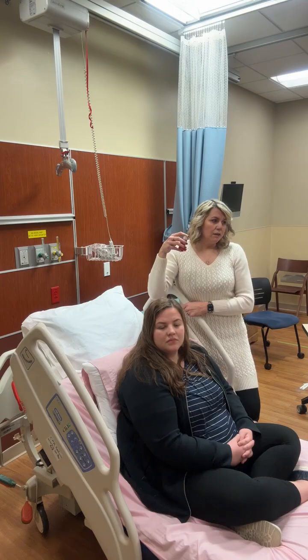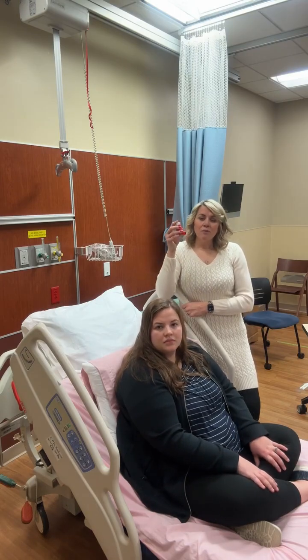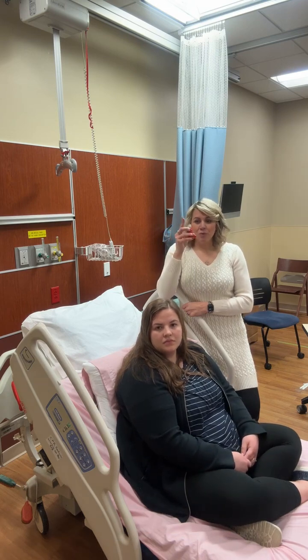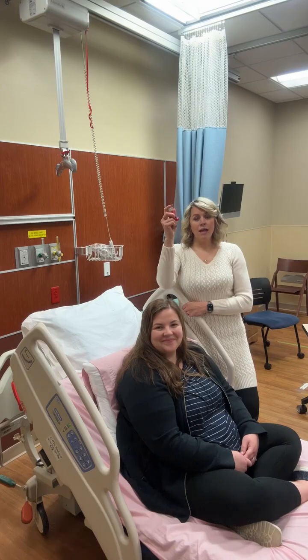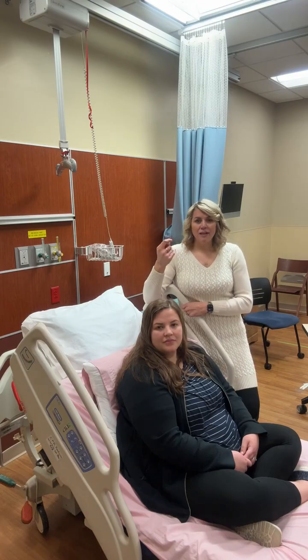Most of the time, the medication will be ordered as 2 puffs, like Q2 or Q4 or PRN for shortness of breath and wheezing. Make sure the patient knows to take a 1-minute break between puffs. If they just do them back to back, who knows how much of that medication they actually got deep into their lungs. So have them do 1, wait a minute, and see how they feel. Do they have any weird side effects? Do they feel extremely dizzy? Do they feel extremely jittery?